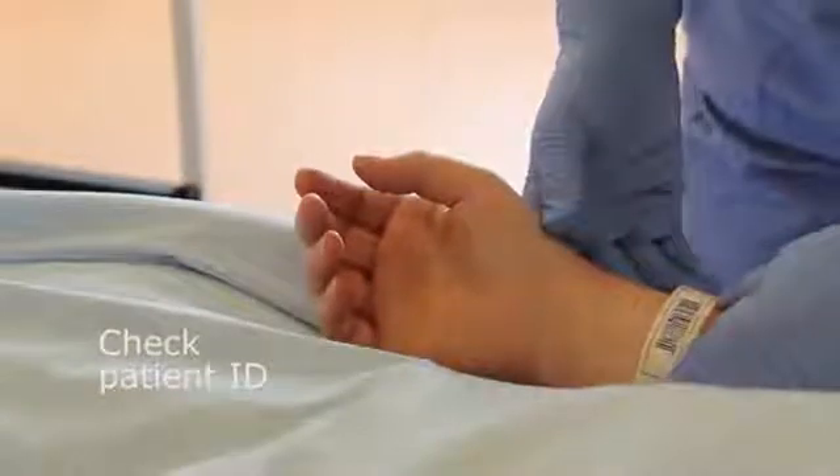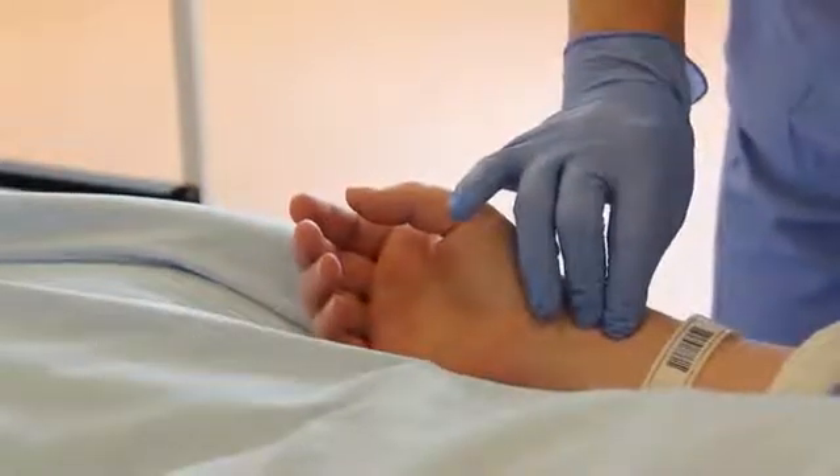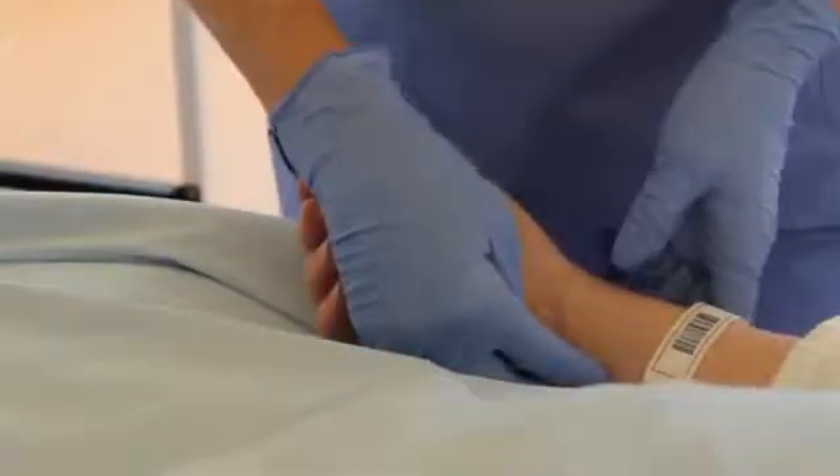Before sampling, confirm the patient's identity. If a recent change in the oxygen flow rate has been made, wait approximately 20 to 30 minutes before sampling.